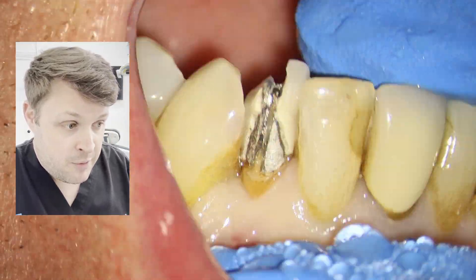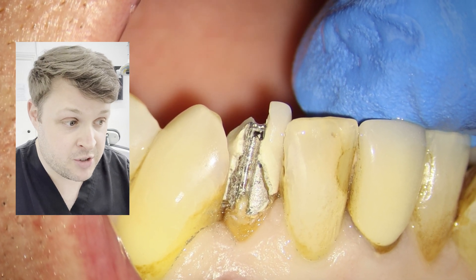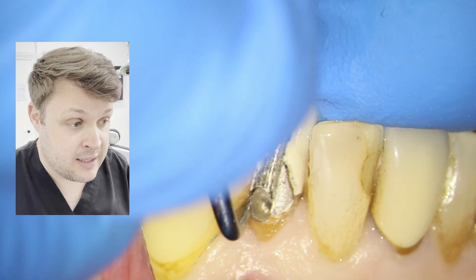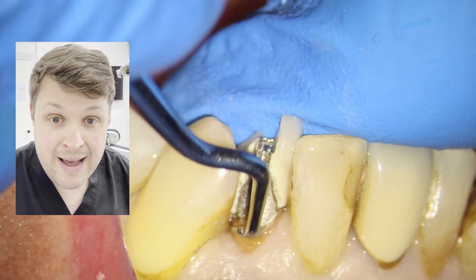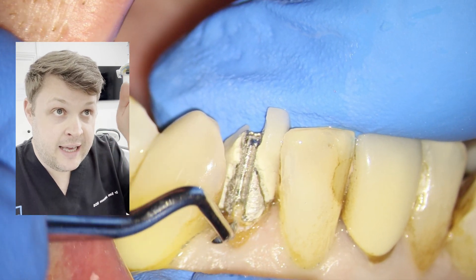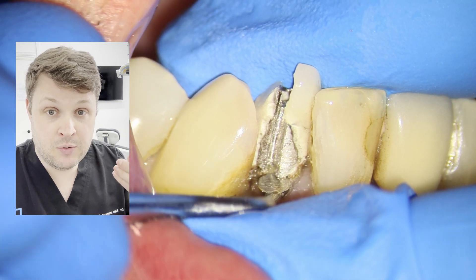Here I am removing the crown. Prior to this I took an impression because the patient obviously doesn't want to leave with no crown in place. You'll notice that this serrated post was metal, so it was really difficult when I was cutting into the crown to know when the crown ended and the post began.